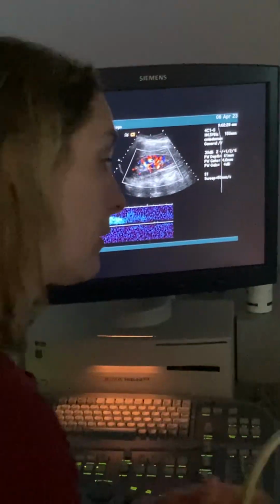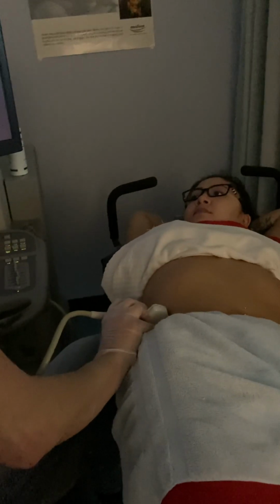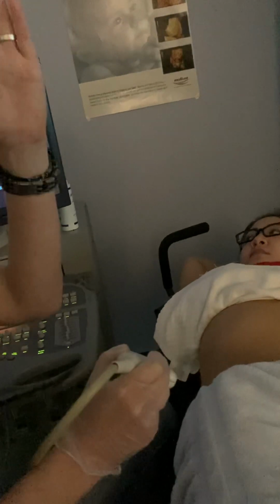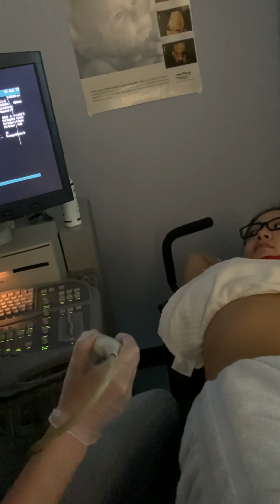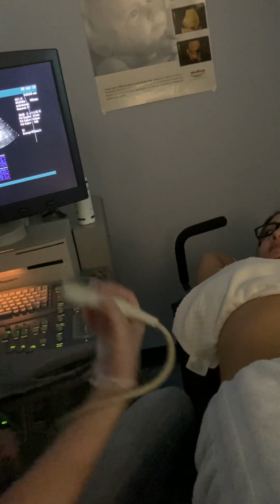And that's why, go ahead and breathe. And that's why these pelvic kidneys are so nice, because you can get the superior. So I could scan from here and get that superior towards myself, or I could scan from here and get that inferior towards myself, whereas we're not fighting the ribs. So these transplant ones are a little bit easier because you can get them to just point straight towards you and you don't have to worry about angle correcting, or at least minimally angle correcting. I think we had one yesterday that was like at 4 degrees. So we were just barely having to angle correct.